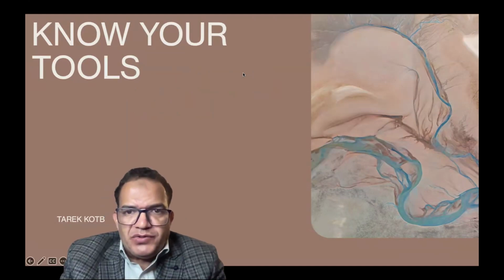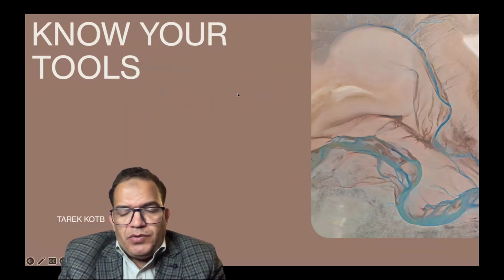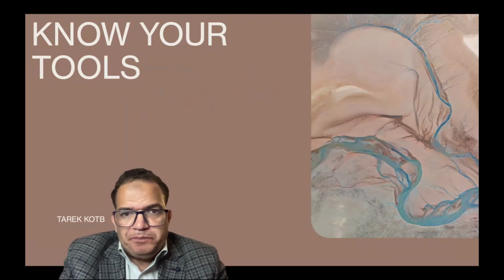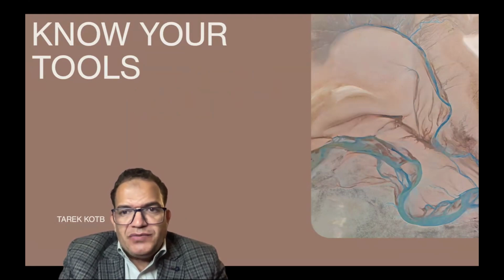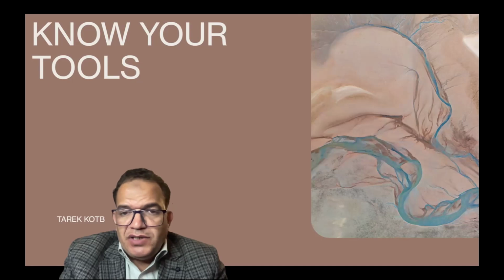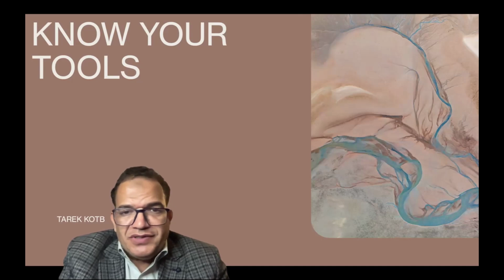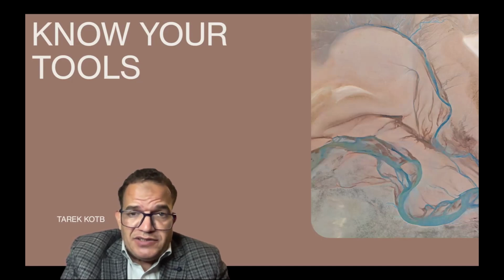Let's start our first session on basic mechanical ventilation, and the first lecture is about knowing your tools. What I mean by knowing your tools: when you admit a ventilated baby to the neonatal unit and connect him to the ventilator, one of your colleagues or the nursing staff asks you, what setting do you want? So you always start with the settings, which are the tools in your hand to control his ventilation.